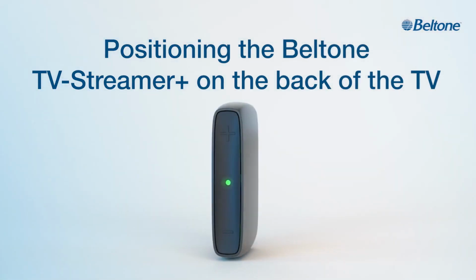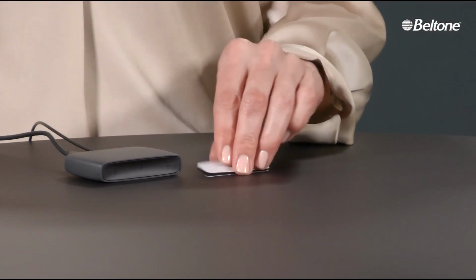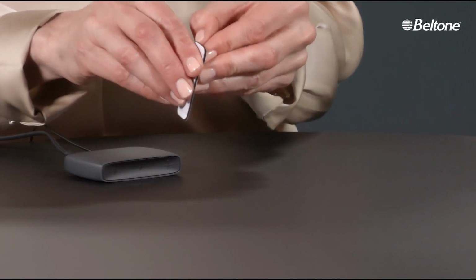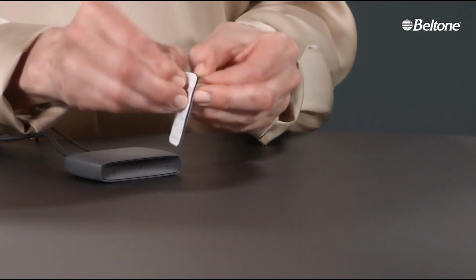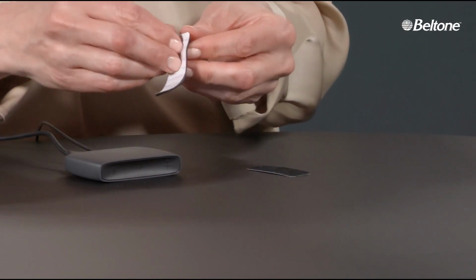Positioning the Beltone TV Streamer Plus on the back of the TV. A plugged Beltone TV Streamer Plus sits next to a set of Velcro adhesive strips. A set of hands pick up the Velcro and begin separating the two strips. One strip is set down and the backing paper from the adhesive side of the other strip is removed.